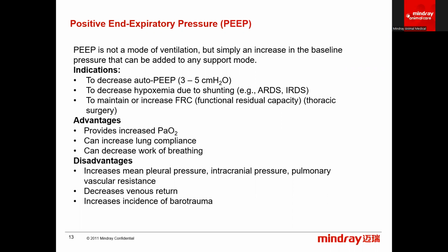It can also help to decrease hypoxemia from different types of systemic diseases. And it can also help to maintain or increase the functional residual capacity of the lungs, especially during something like thoracic surgery, where the lungs are out in the world, and they're no longer constrained by a chest anymore. What's going on? They don't know what's going on.